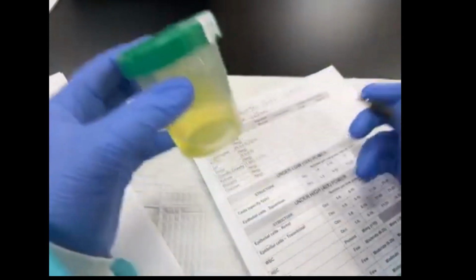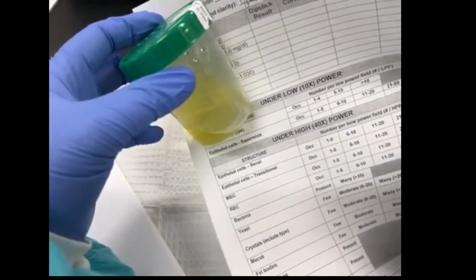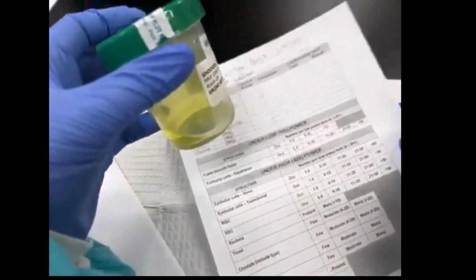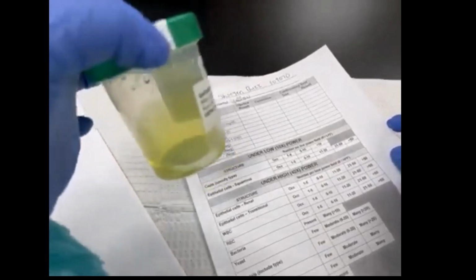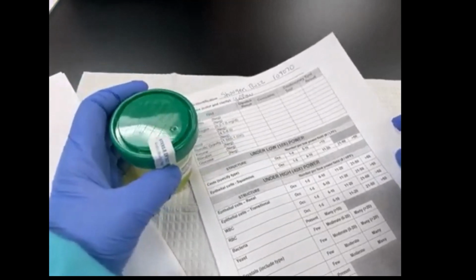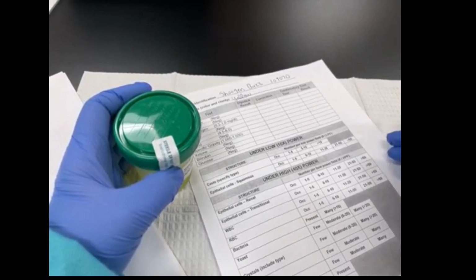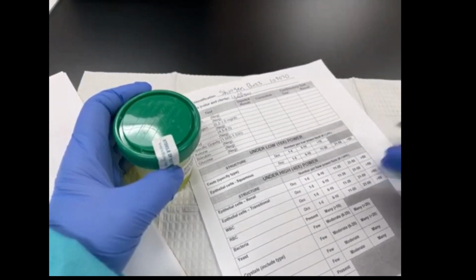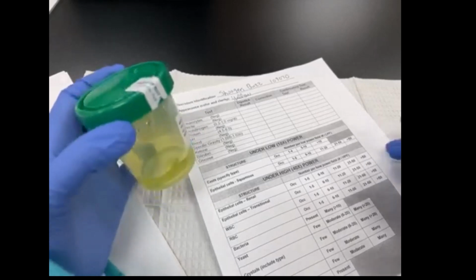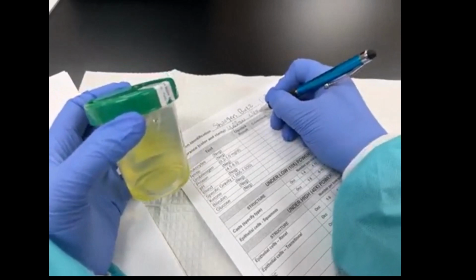So when I'm looking at this, it's yellow and it's pretty clear because when I hold it up against my paper, I can read through it. Now, one thing you always have to remember when you're doing this is you have to tare the actual cloudiness of the container. So you can see this urine container is a little bit cloudy. So you have to mentally tare it, T-A-R-E, like you do the scales when you're measuring something by weight. You have to tare it to a 0 because you have to make sure you're not weighing the weigh boat and counting that into your measurement. So you have to mentally tare it off. So I can tell you right now, looking at this is a very clear urine.